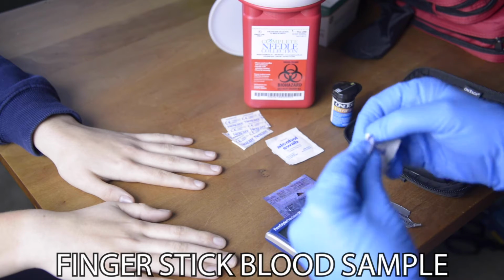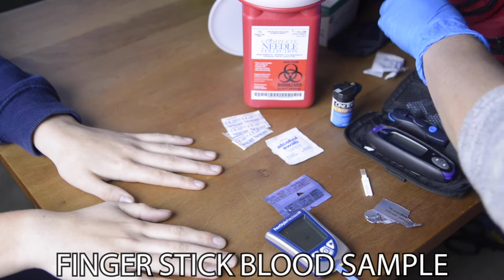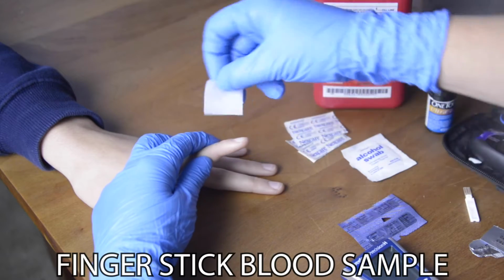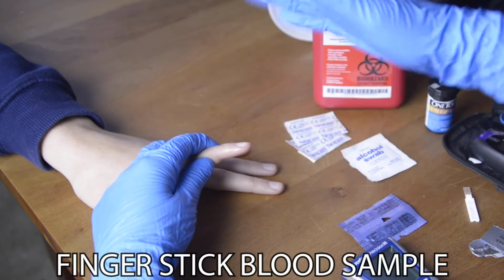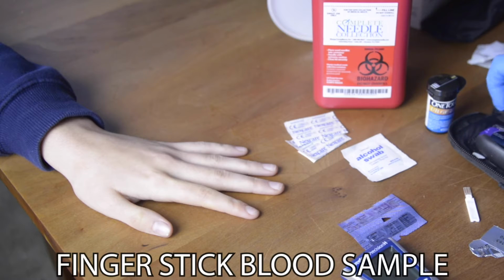Now generally, if they're right-handed, it's nicer to test on their left hand. And you want to test on the side of the finger rather than the front of the finger. So I'm going to wipe it with alcohol, fan it, let that dry while I set up my lancet.